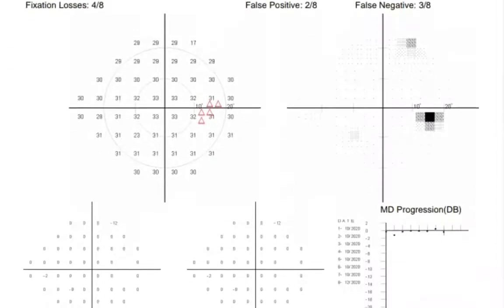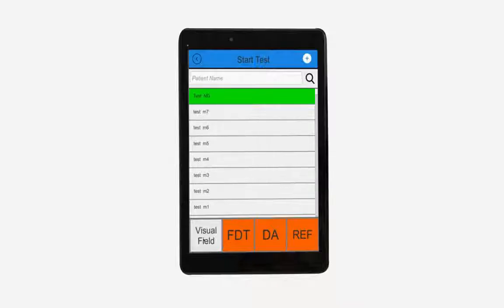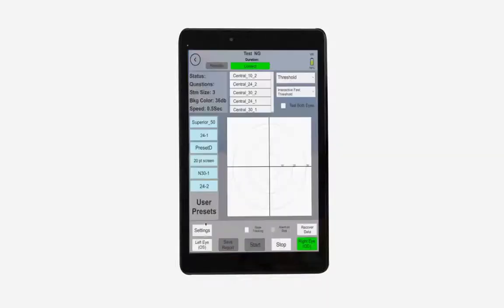The VF2000 can run a full battery of tests and screenings, including the most common full-threshold visual field tests, ptosis tests, the Estermann test, and screening for any neurological conditions that may be affecting vision.